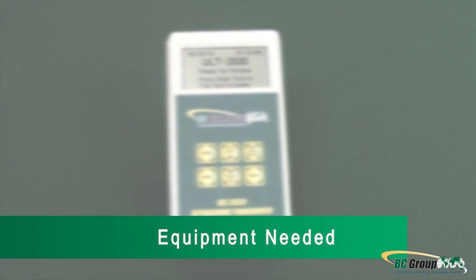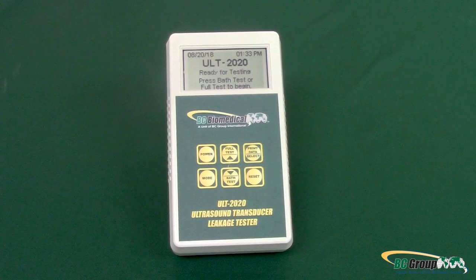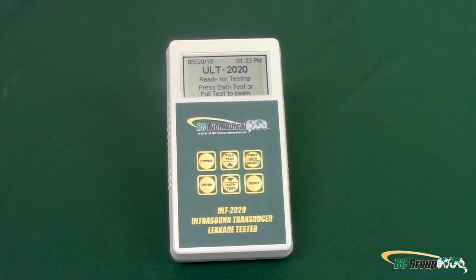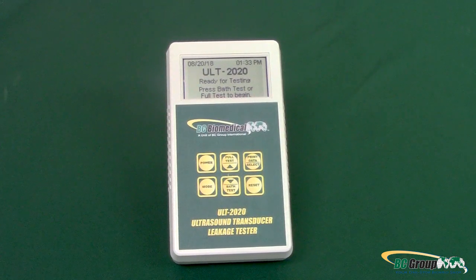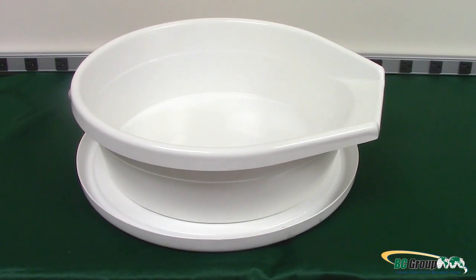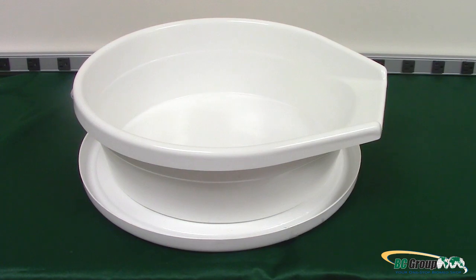Equipment needed: ULT 2010 or ULT 2020 Ultrasound Leakage Tester. For this demonstration, we will be using the ULT 2020. Soak tray, tube, or TD100. For this demonstration, we will be using a soak tray.